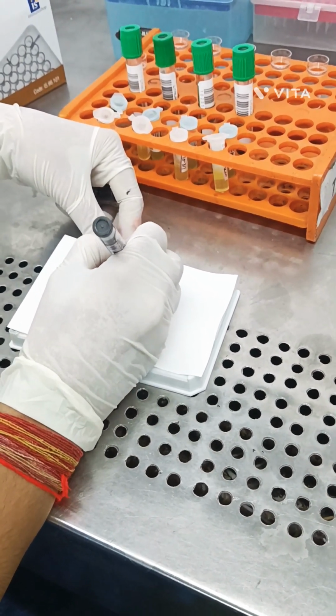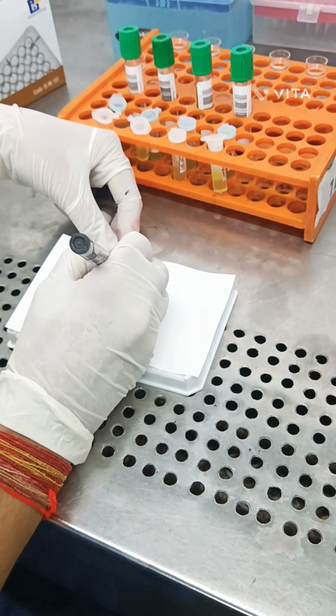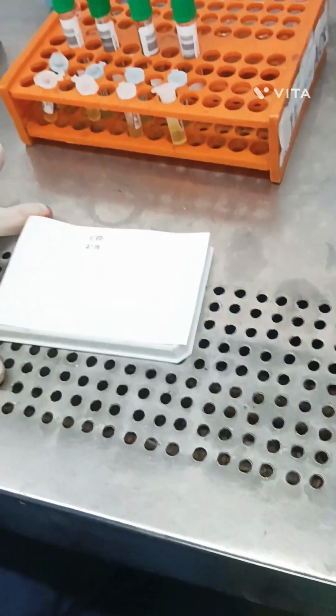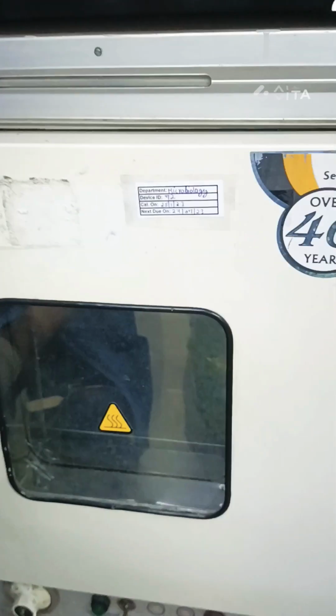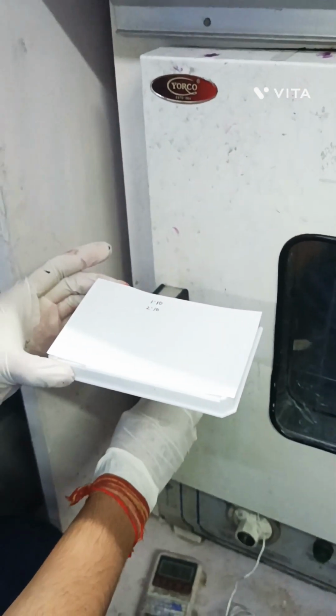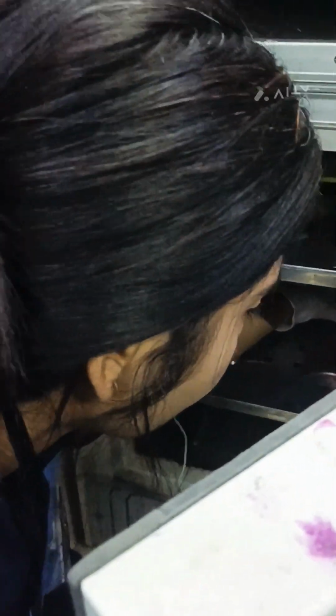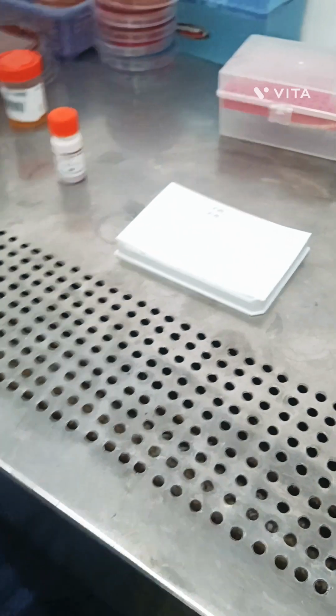After the procedure is done, take 1 hour of incubation and keep at 37° in the incubator.